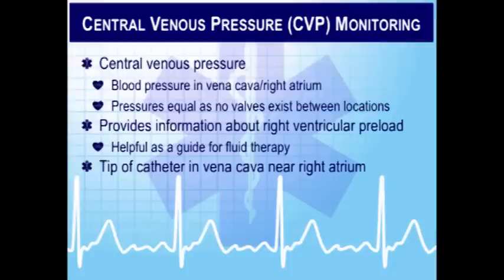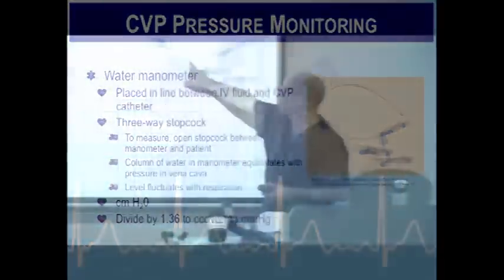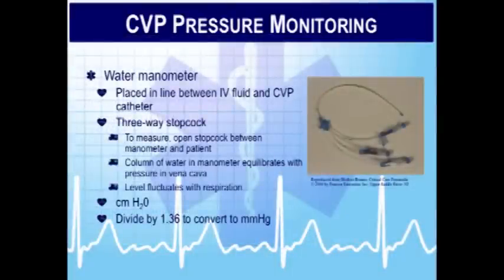So now we know the technical definition of a central venous line: a central venous catheter whose tip lies at the junction of the SVC and the right atrium, or actually in the right atrium. There's a good example of a triple lumen central line, and here's where I could determine whether it's distal, proximal, or medial. Always going to choose the distal for transduced monitoring.